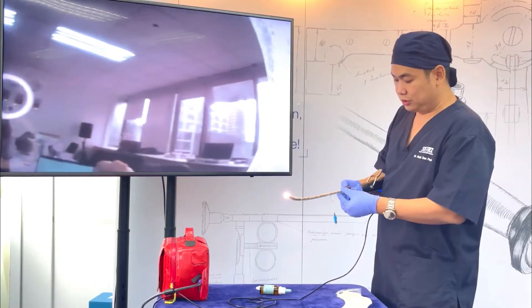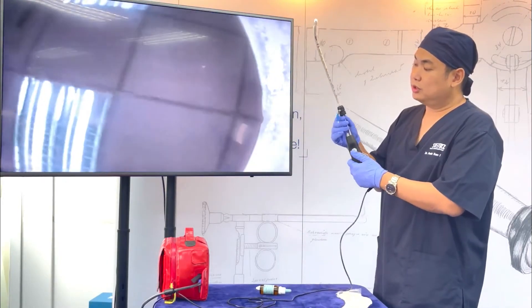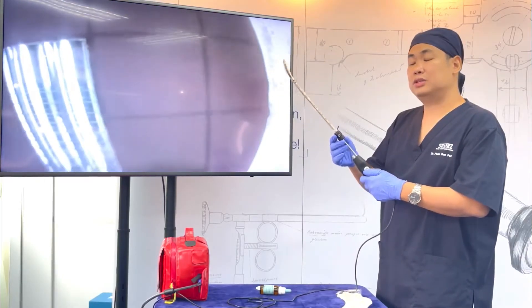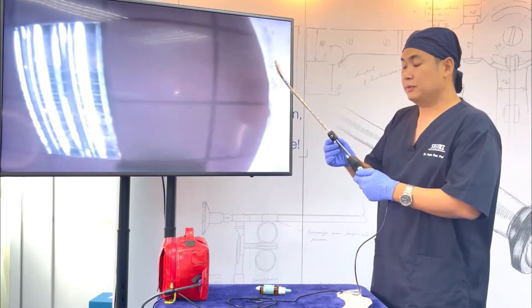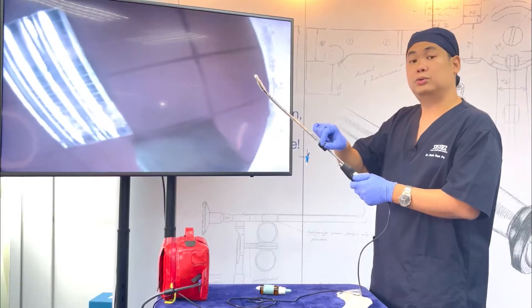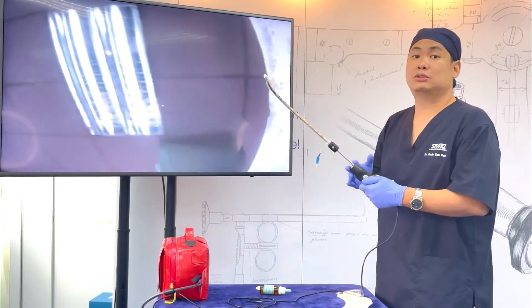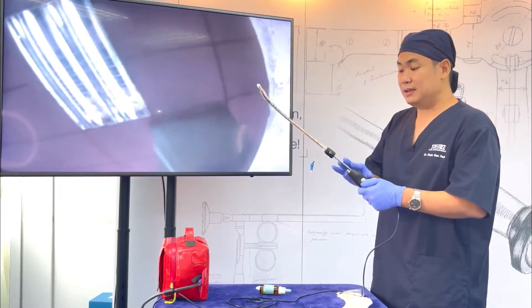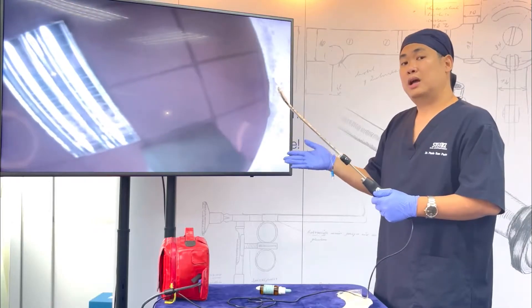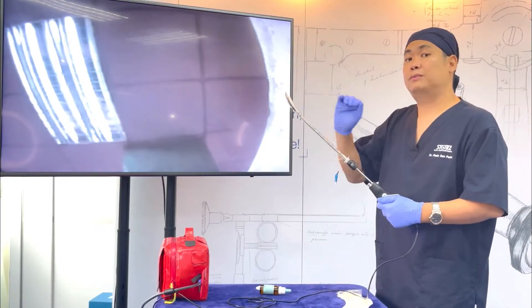Adjust the tube holder to secure the ET tube. The tube holder has an O2 port. If you anticipate a difficult intubation or if you're afraid that the patient will desaturate, you could place O2 on the O2 port. This will serve as apneic oxygenation for the patient. At the same time, the oxygen will blow away secretions, blood, and saliva away from the view of the scope.